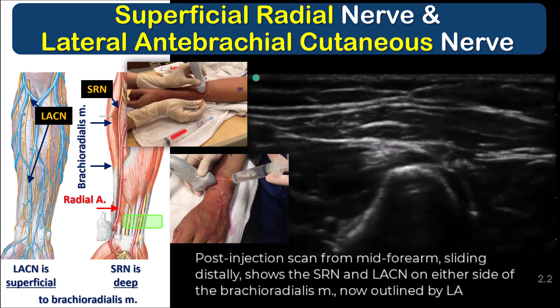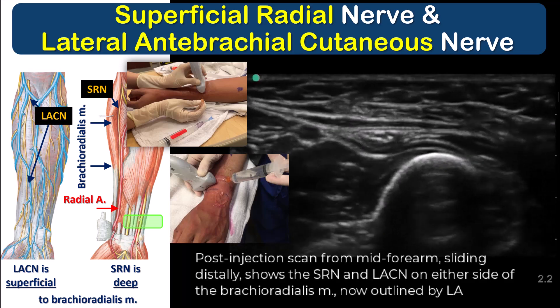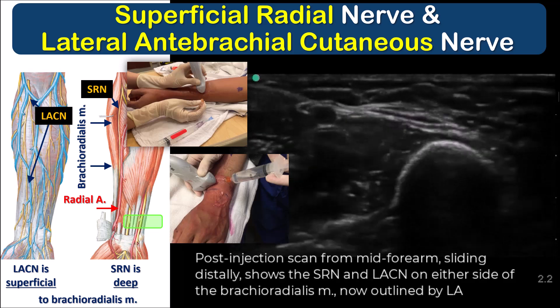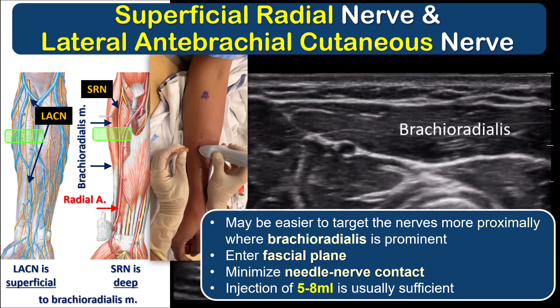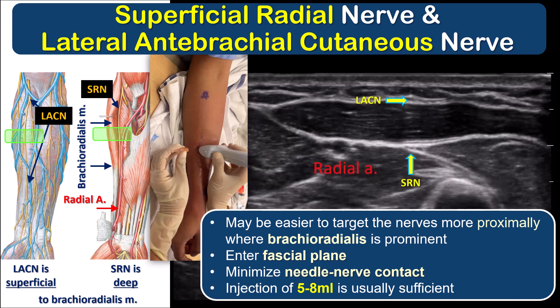This post-injection scan shows the nerves now clearly outlined by the surrounding local anesthetic. Note that because these are both purely cutaneous nerves, you can block them higher up than the median and ulnar nerves, in the mid-forearm where the brachioradialis muscle is more prominent. In particular, if you choose to use a 22-gauge blunt-tipped block needle, you'll likely find this more proximal approach to be easier and more forgiving for getting the needle safely into the correct planes. Aim to pierce the fascia away from the nerve to avoid needle-nerve trauma, and let the local anesthetic jet find its own way to the nerve.